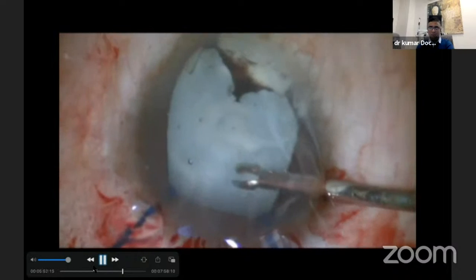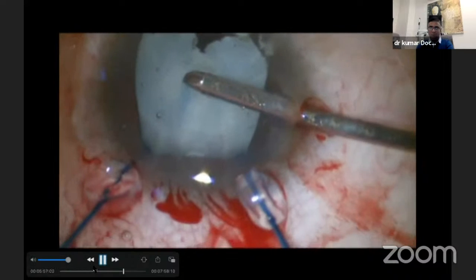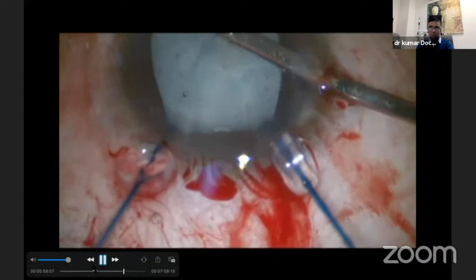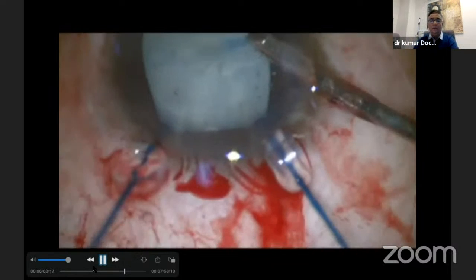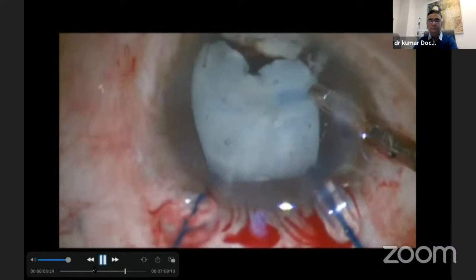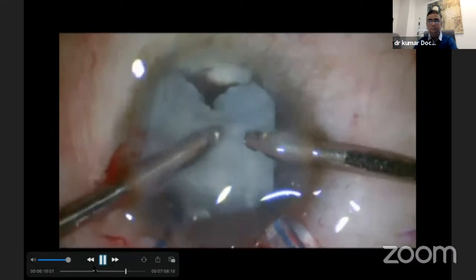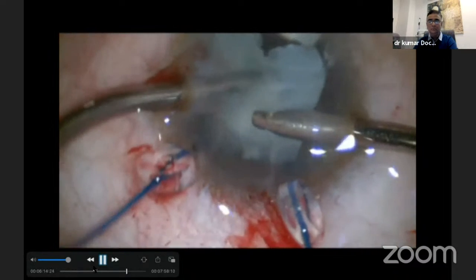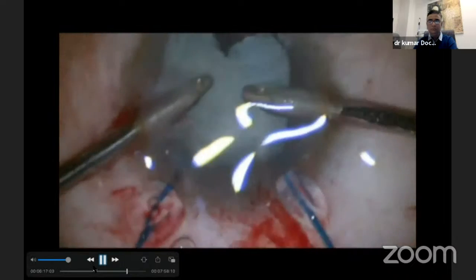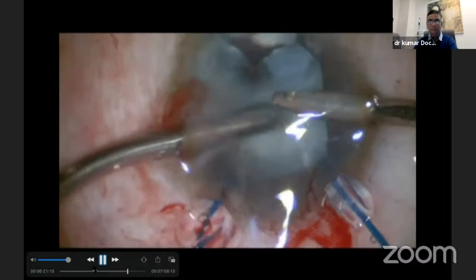Main incision of 2.6 mm made and the capsule was stained. The rhexis was made with a micro-rhexis forceps. Bimanual IA for the soft lens material was done. The opaque plaque inferiorly in the area of the iris coloboma was left as it would help the patient to filter off the extra light.